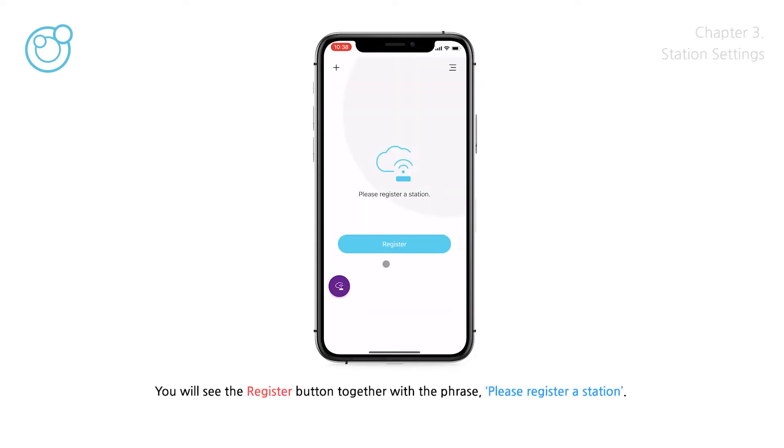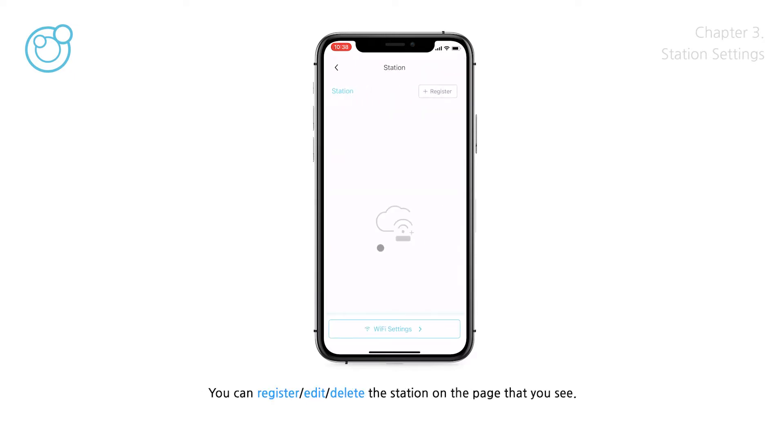You will see the Register button together with the phrase 'Please register a station.' You can tap the Register button or the Station icon at the bottom. On the page that appears, you can register, edit, or delete the station. In addition, you can connect the station to Wi-Fi or set a device.